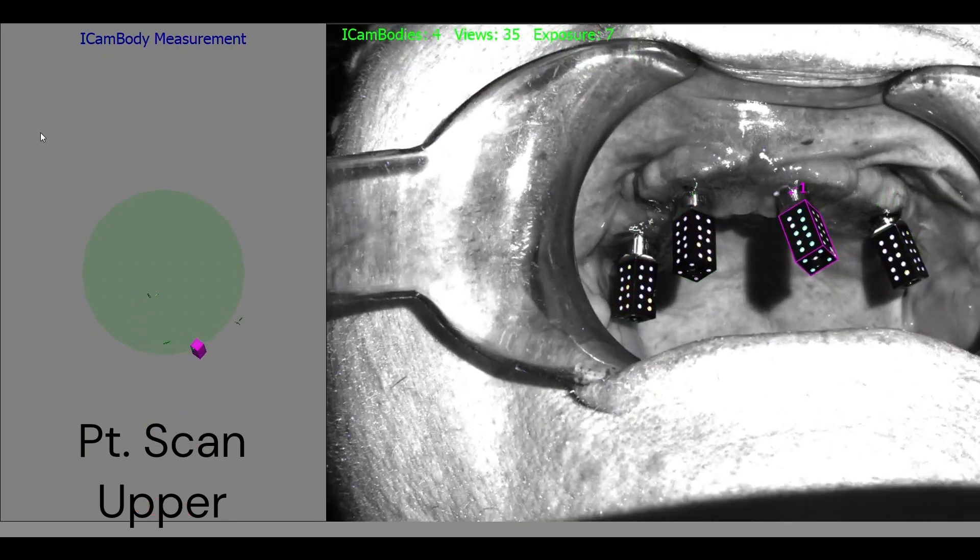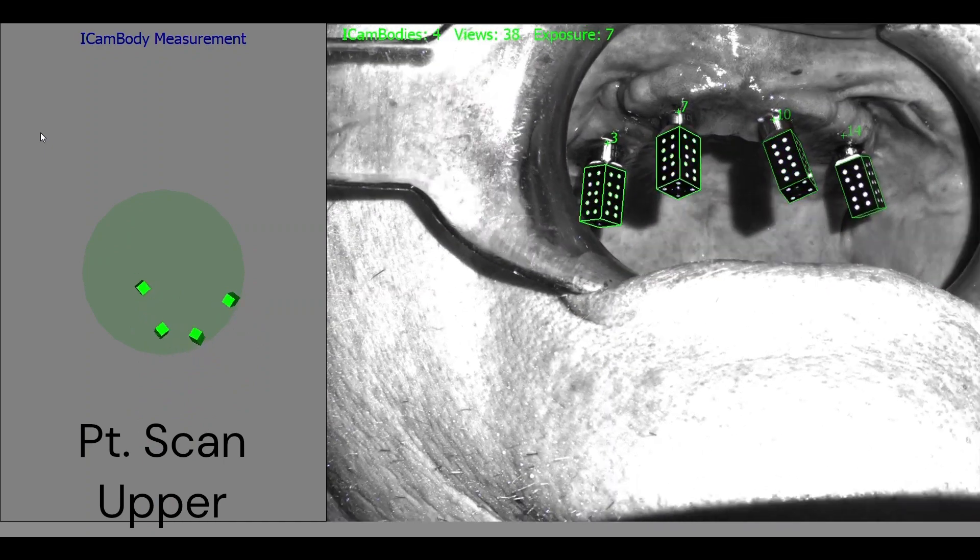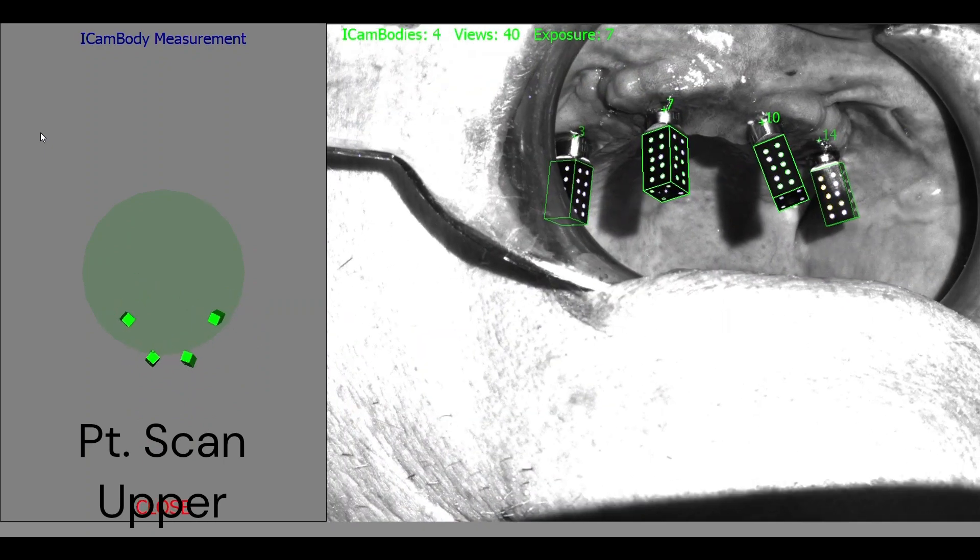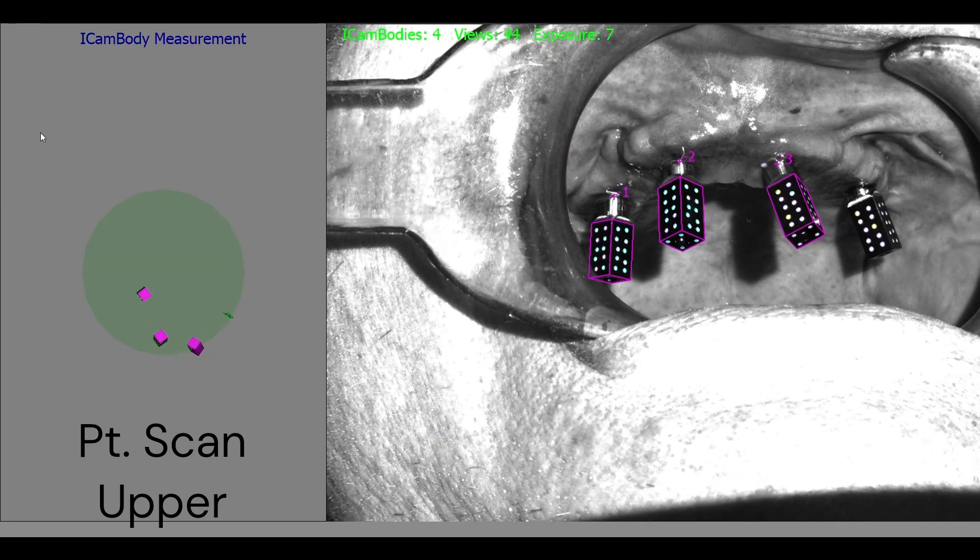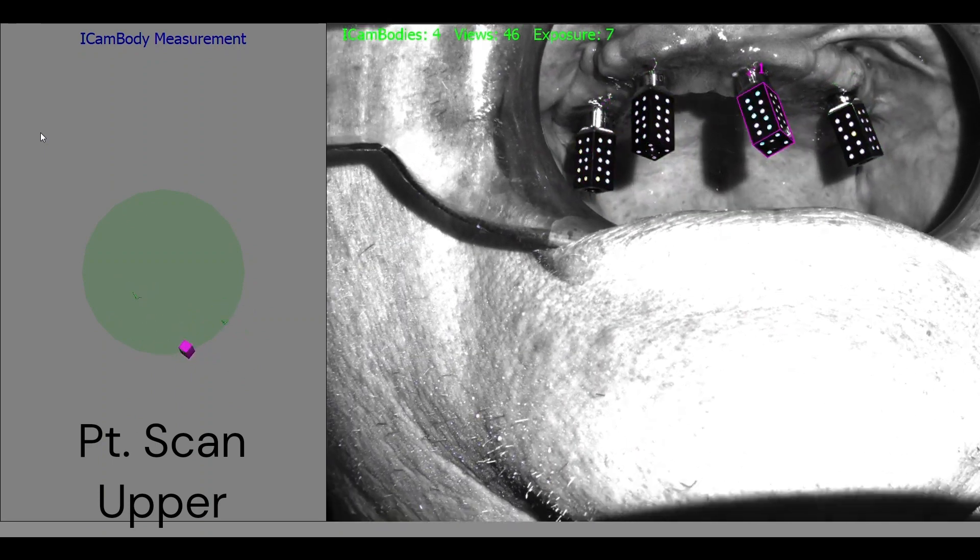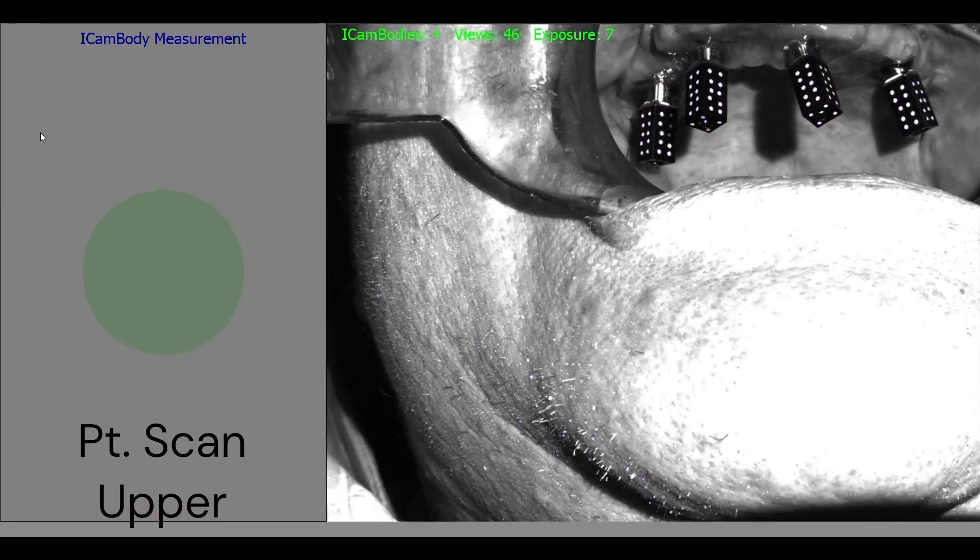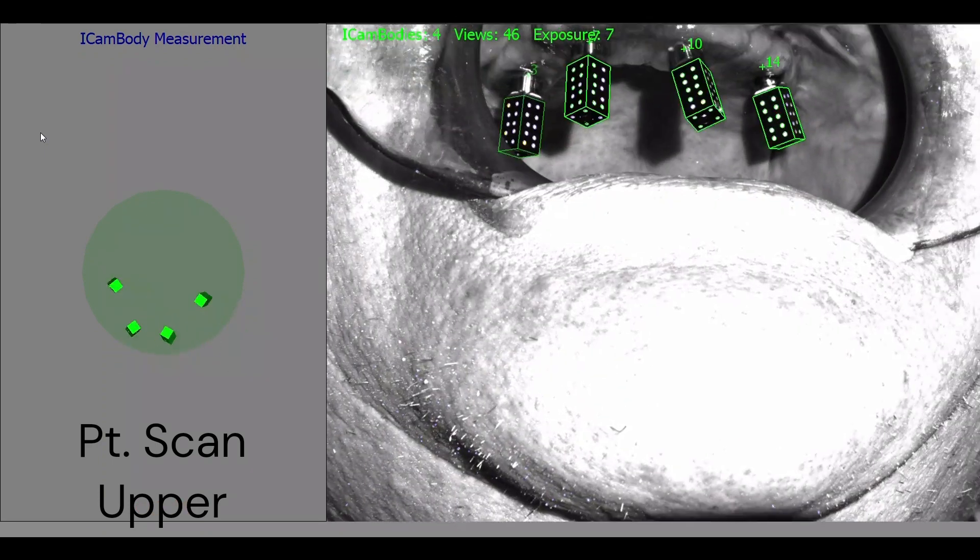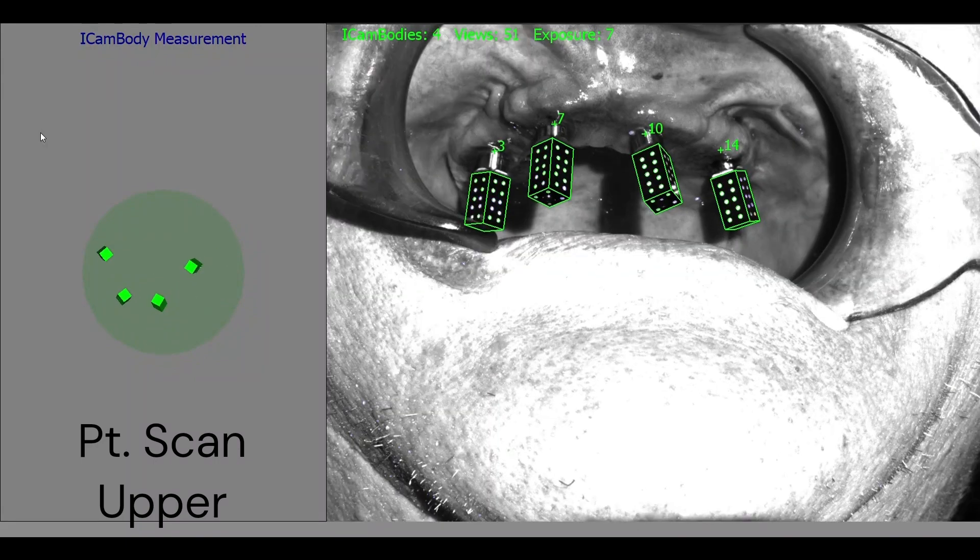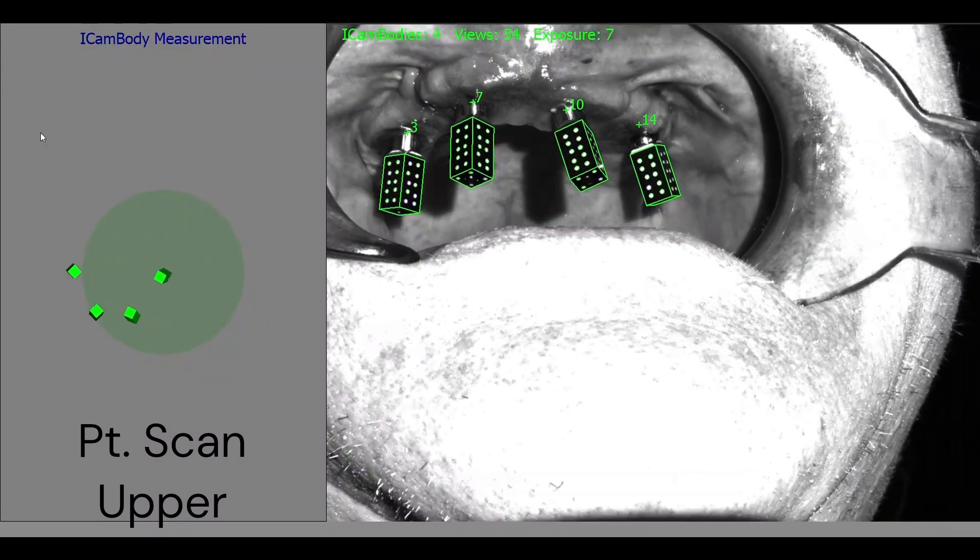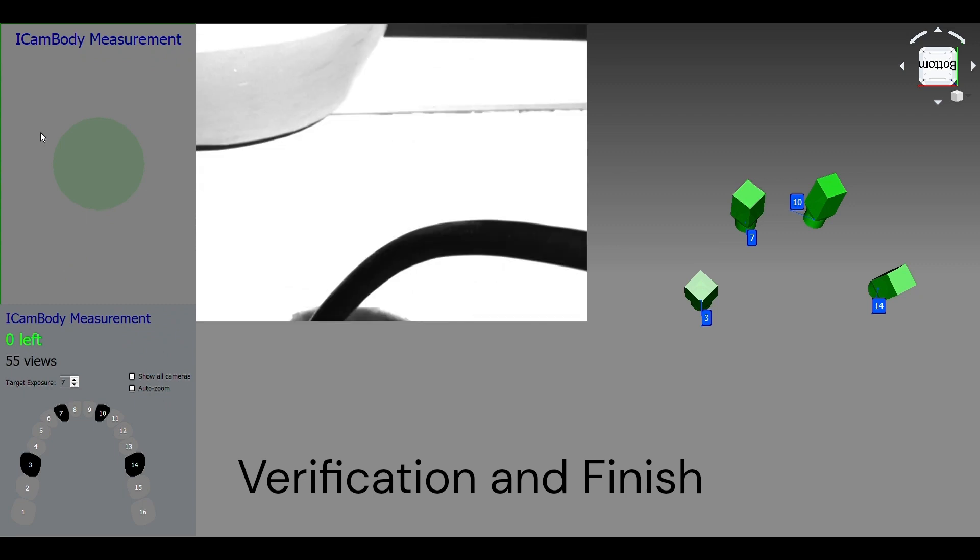So, Cassie, see how that green circle, see how the little flags are within there? Yeah. That's how you know you're at the right distance. You're within the proper capturing. You see how they're all lighting up green, which is good? We're at 52 views, so we're good to go. Yay, good job.